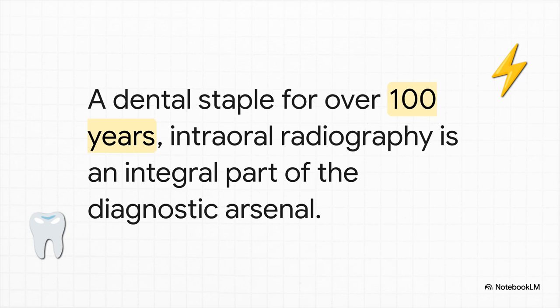Oh yeah, we've all been there, right? You're in the chair, they drape that heavy apron over you, you gotta bite down on that little cardboard tab, hold perfectly still, hold your breath, and you hear that quick beep. It's the standard, the absolute go-to diagnostic tool for dentists everywhere.